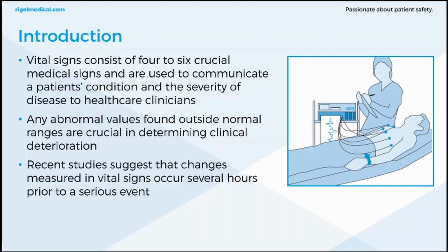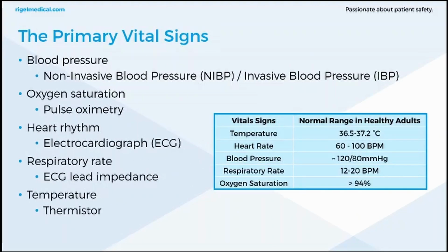Modern patient monitors warn of pending fatal cardiac conditions before visible signs are noticeable to clinical staff. So this is very crucial in determining a patient's condition before anything becomes obvious, and that became apparent in COVID-19, how crucial patient monitoring systems have been to clinicians.